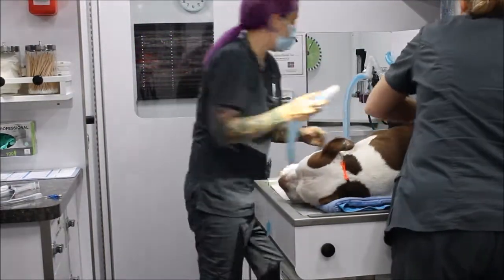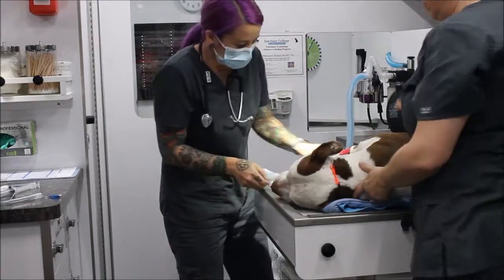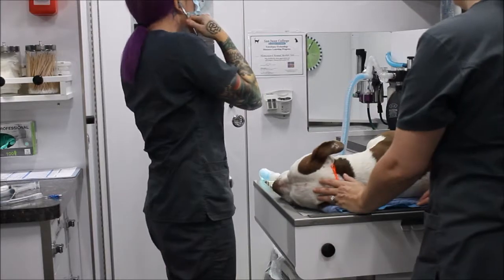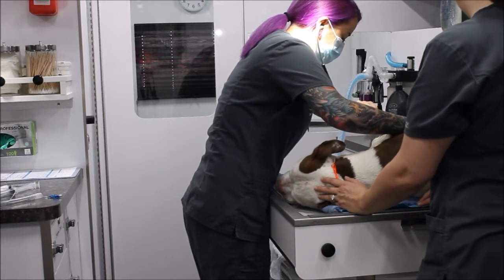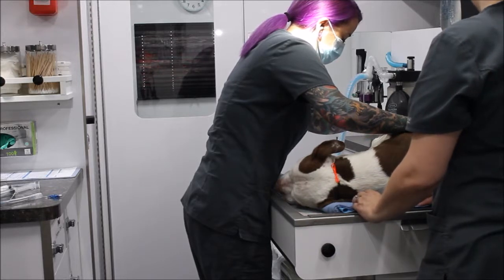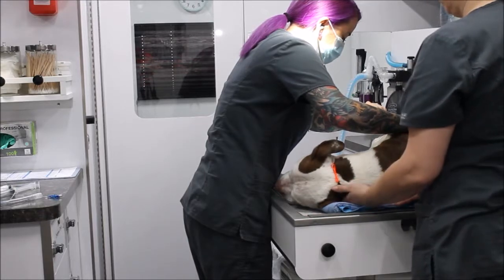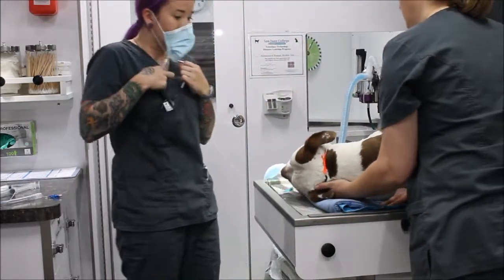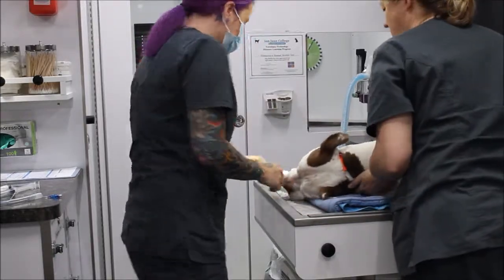Now I'm going to go ahead and hook him up to oxygen, and then I'm going to take a heart rate. His heart rate is 90, so that's okay.